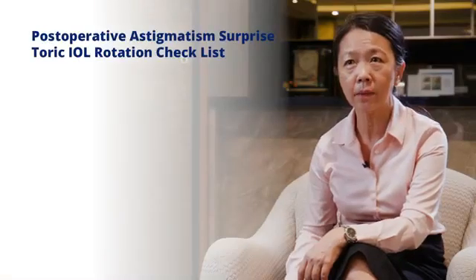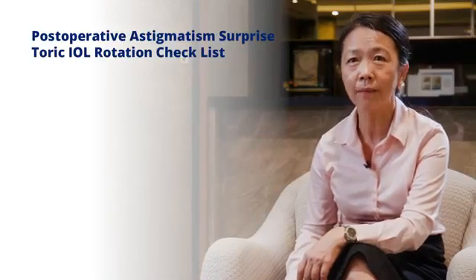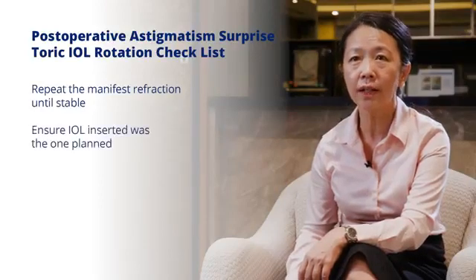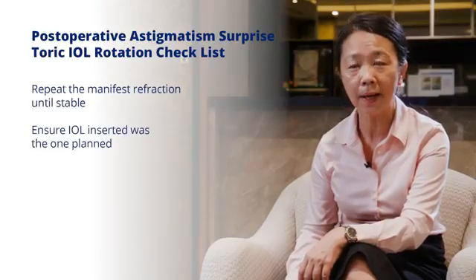I'll be talking about surgical steps to toric IOL rotation. So if you're faced with a patient with postoperative astigmatism surprise, first thing you should do is don't panic. Repeat the manifest refraction until it's stable. Ensure that the IOL inserted was the one that you had planned.